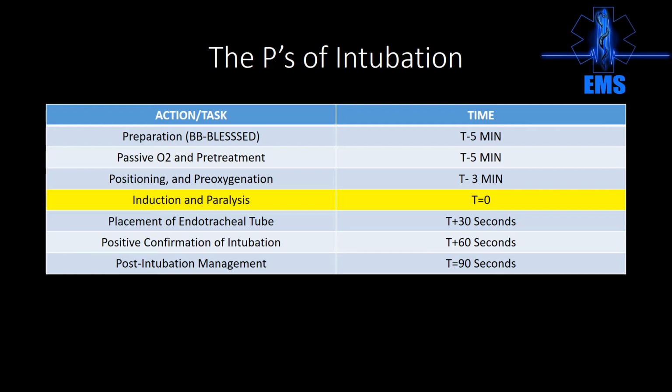That being said, you need to squeeze the bag gently at a rate of about once every 6 seconds. And again, the position of the airway is the most important thing. You need to overcome the resistance of the tongue, so you need to have some type of an external airway in there, whether it be an OPA or an NPA. If the patient won't tolerate an OPA, maybe we need to ask, does the patient need to be intubated?